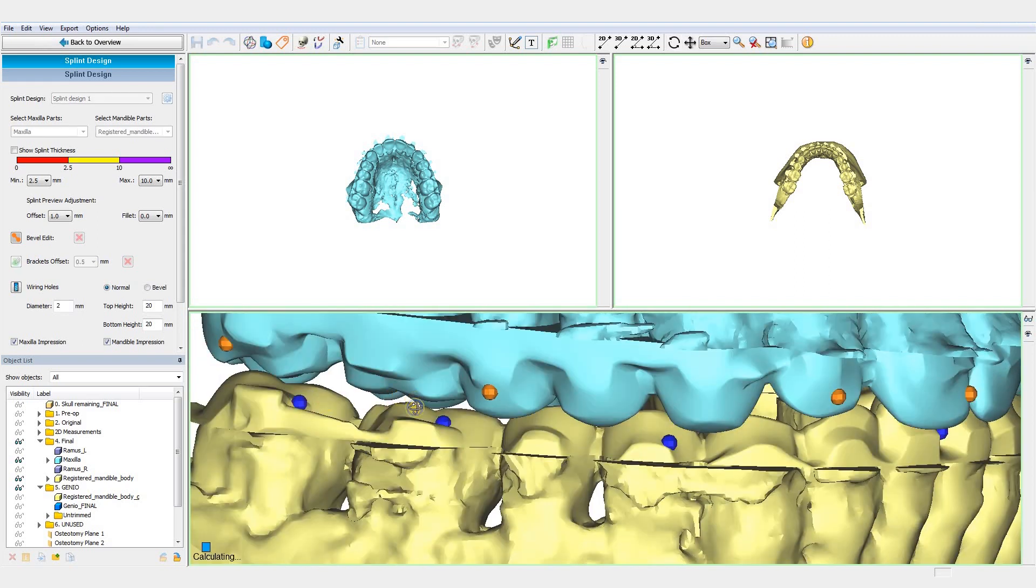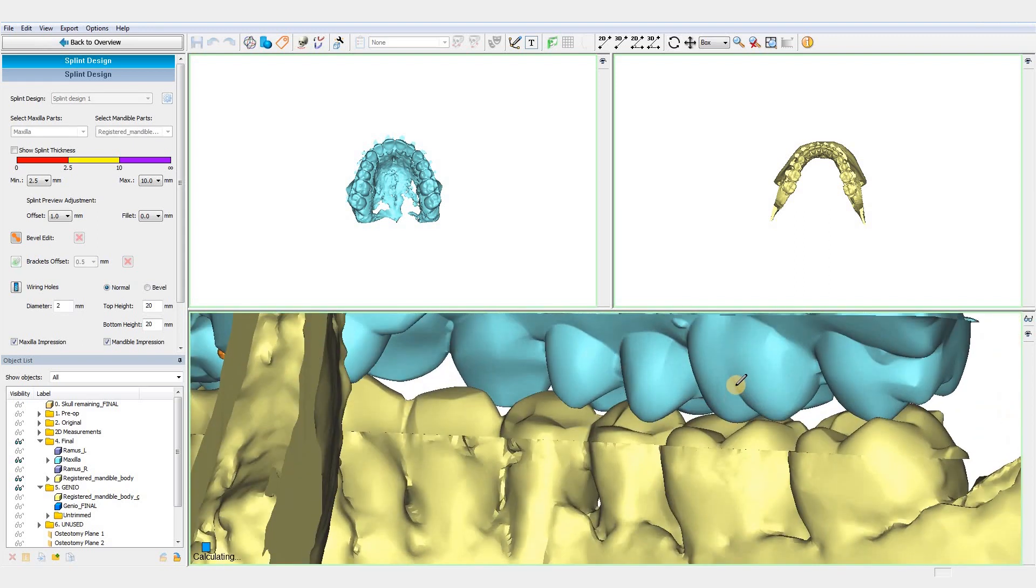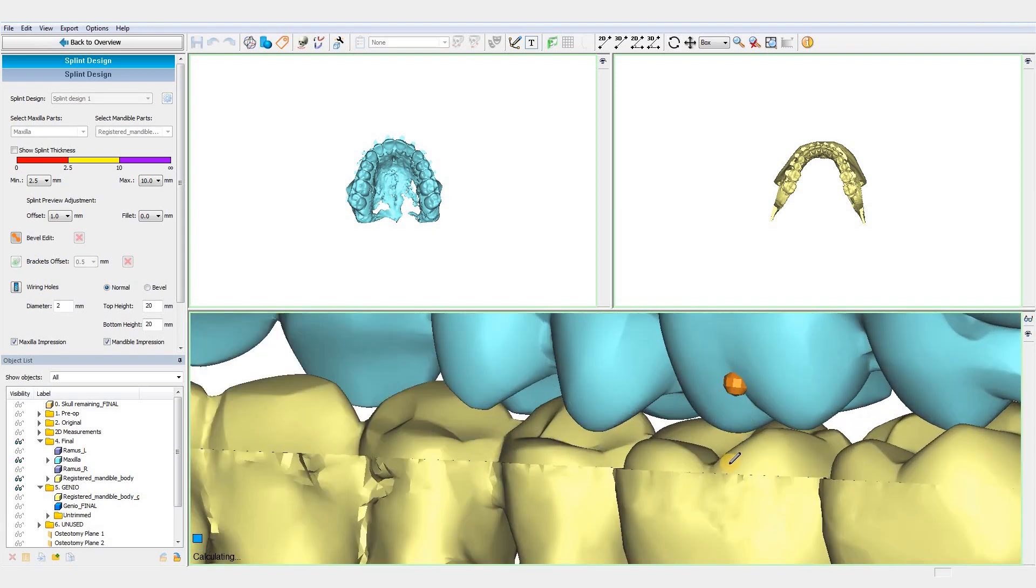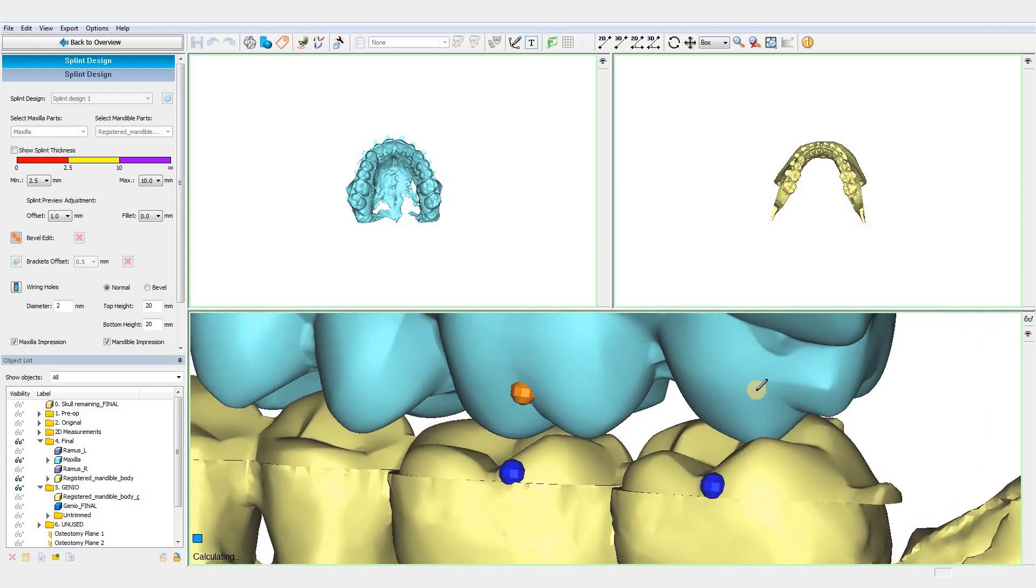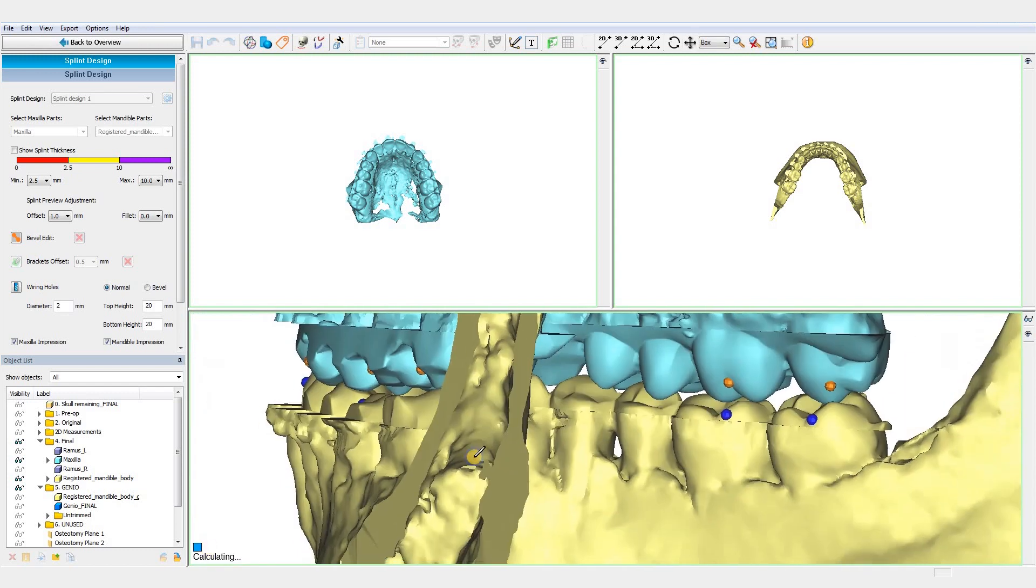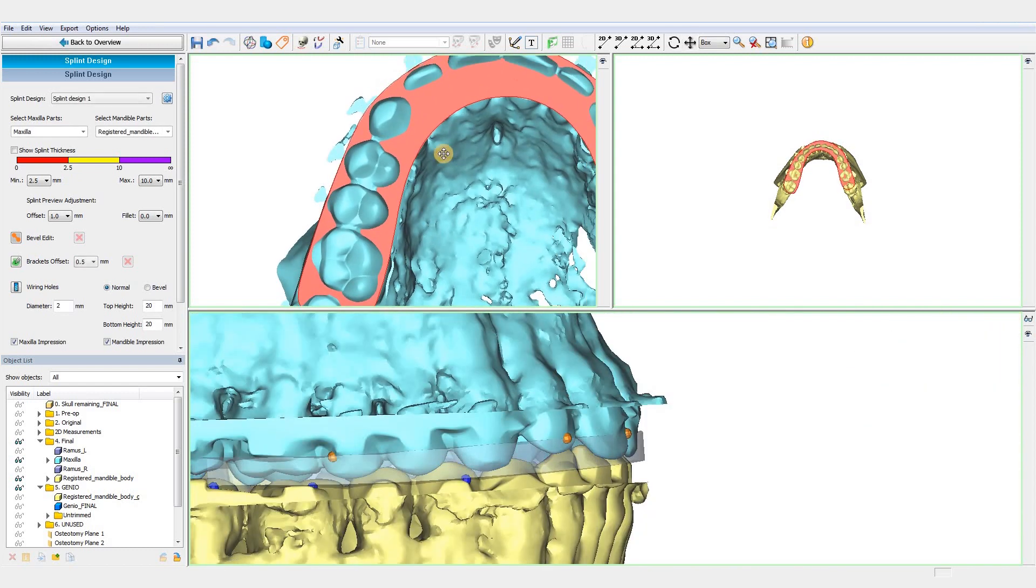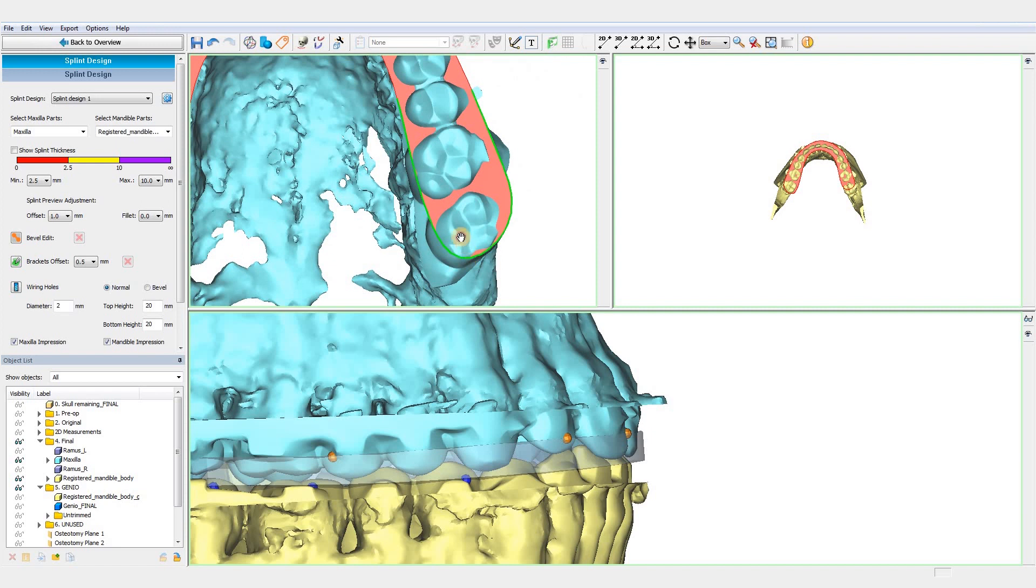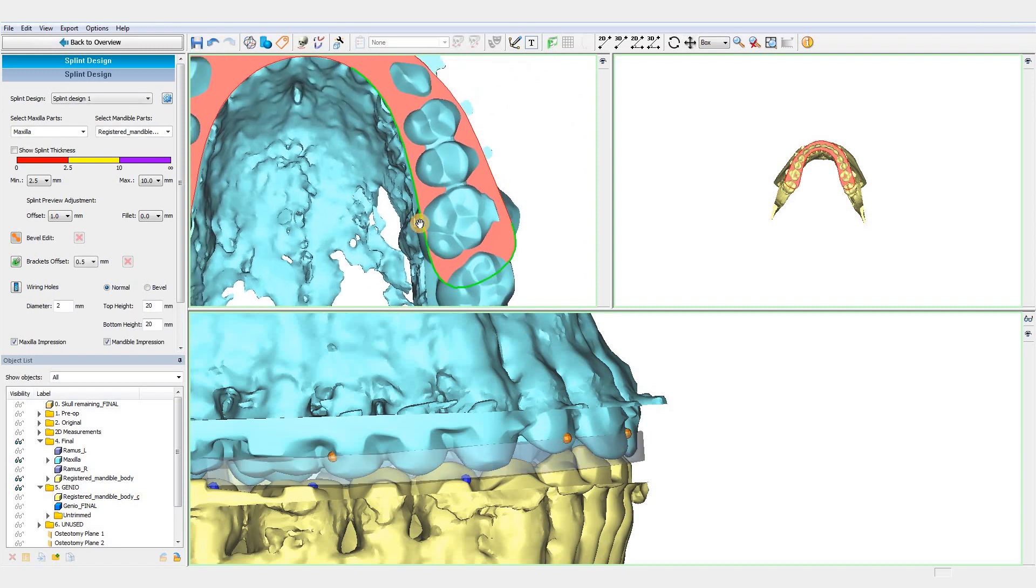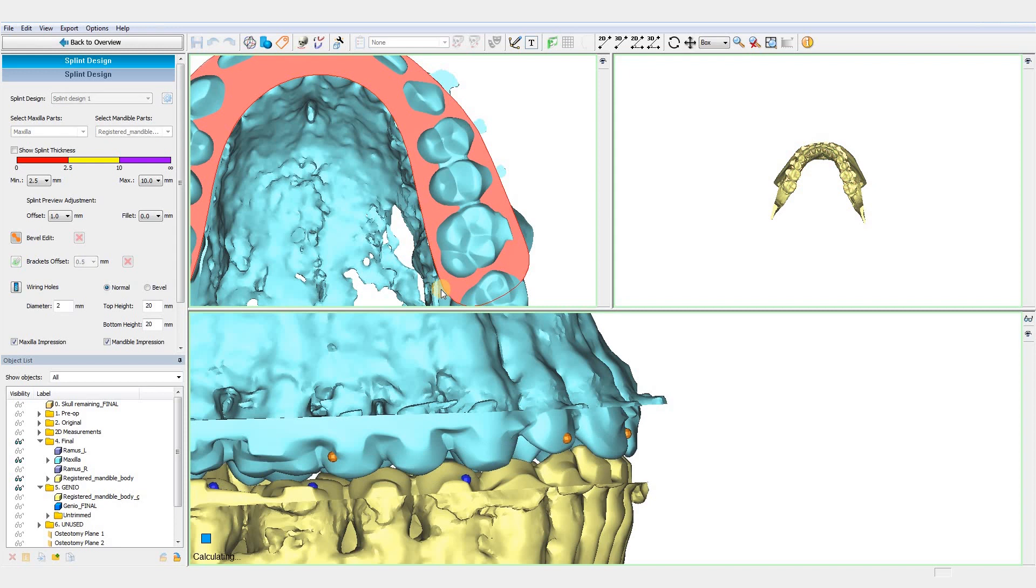Then, we can fine-tune this design and adjust the splint outline to our needs. To do so, we just need to grab and move the points. Moreover, we can control the size of the green line by holding ALT. Finally, we can also increase the whole size of the splint with the offset tool.